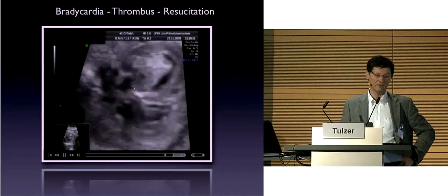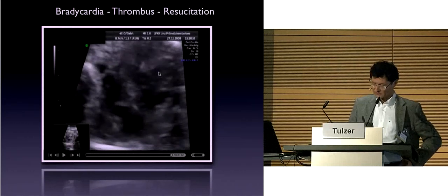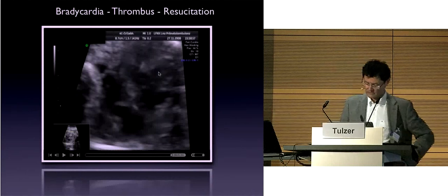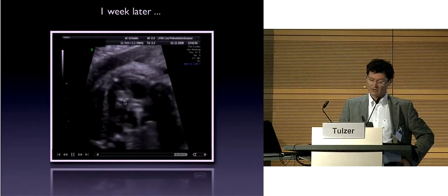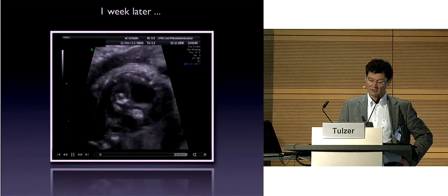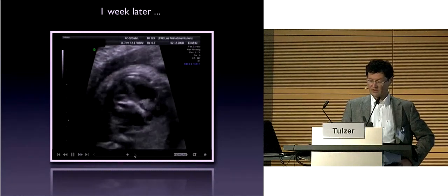Now the left ventricle is filled with thrombus and the heart is almost stopped, so we go back and puncture the left ventricle again with a very thin needle and give epinephrine intracardially, which is successful in most of these cases. Usually within seconds the heart rate and pressure come up, but now you're stuck with this huge thrombus in the left ventricle, so you have no more sight and you cannot repeat the procedure. You have to wait for a couple of days. This thrombus dissolves within a few days, usually without any treatment, and about 1 week later we repeated this procedure. Now we are back in the left ventricle with the needle crossing the aortic valve. You can see some residual thrombus still in the LV, just to make it a little bit shorter.